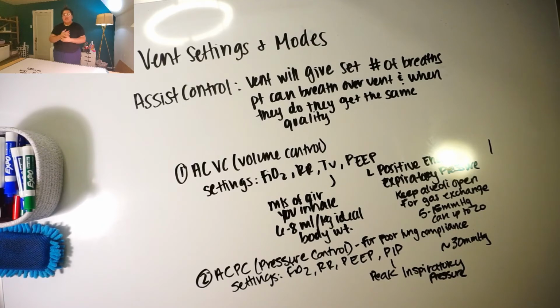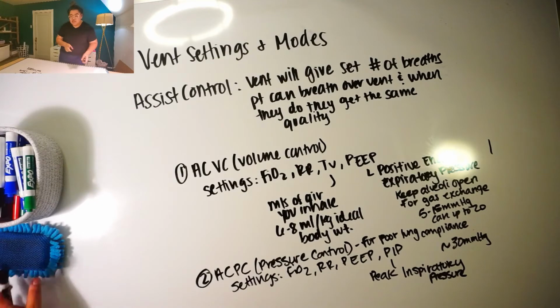So that's why with mechanical ventilation, you got to get these people sedated when they're intubated. When they're trached, they require that ventilation for a little bit longer, but with the trach, you can give them less sedation, unless of course they need it to keep them calm on the vent. Okay, so that's assist control.